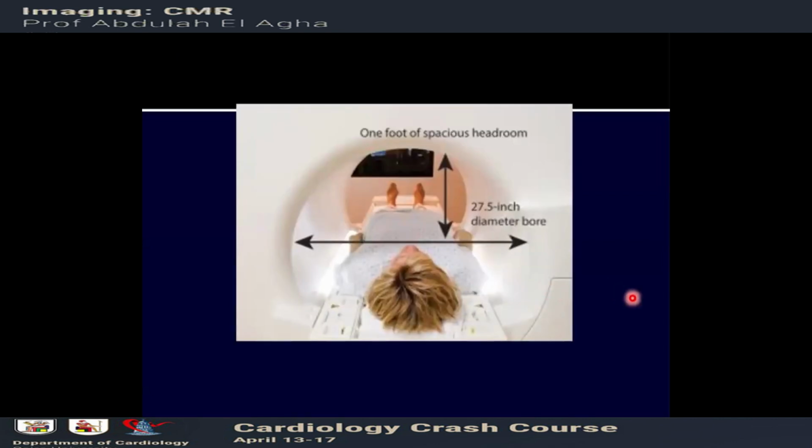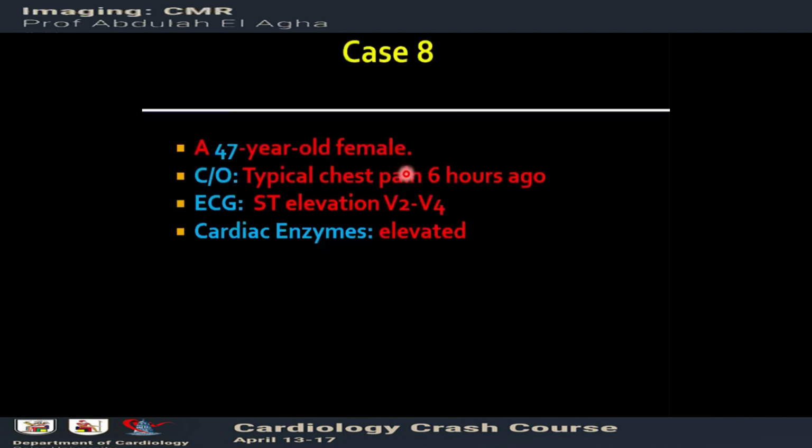Cardiac MRI, as you know, is now wide bore, so the claustrophobia that used to be common has become much less. The wide bore gives the patient more space, so we encounter less claustrophobia in patients.